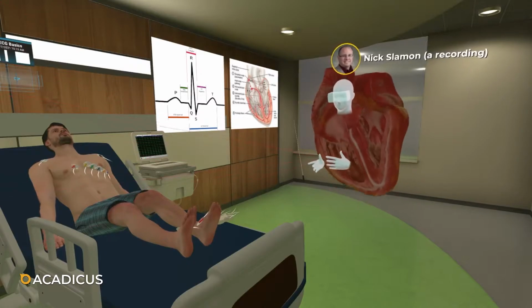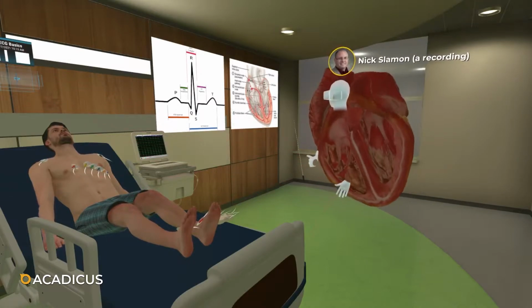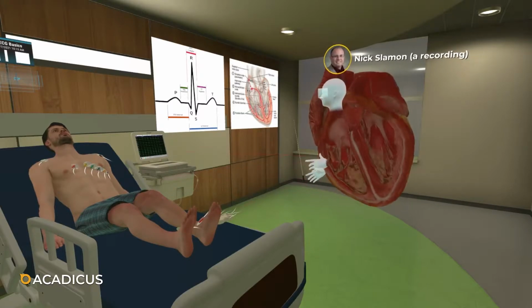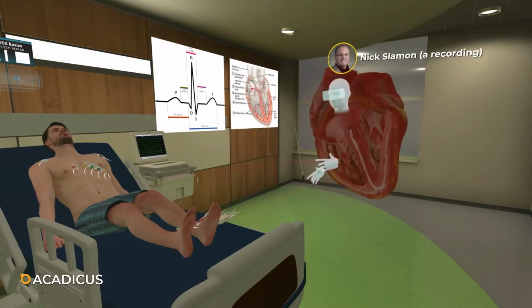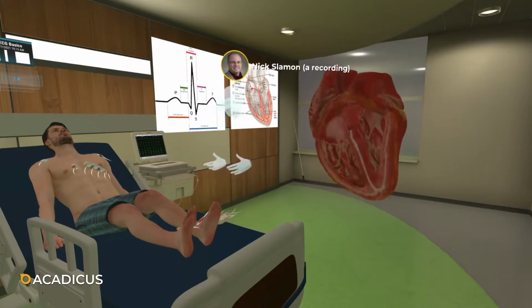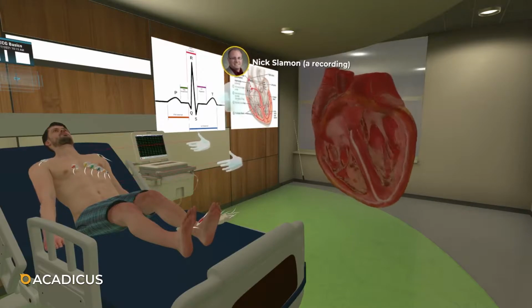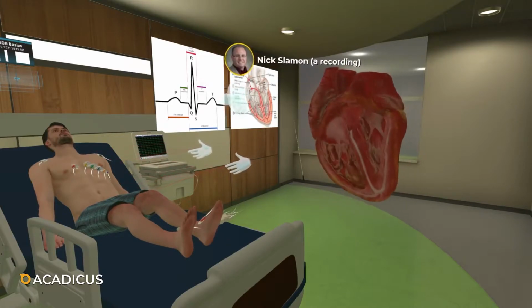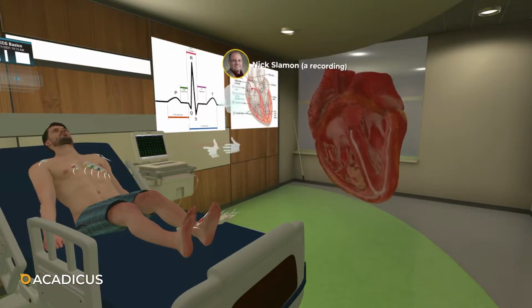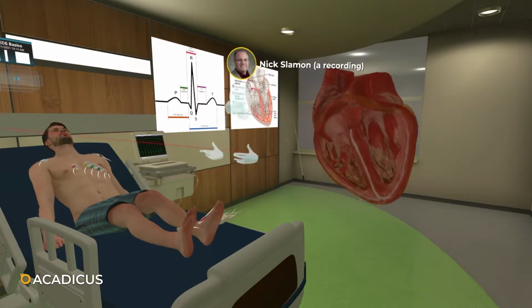In today's tutorial, we're going to go over some very important but very basic concepts surrounding EKG. So let's start with our patient here, Simon, and notice that he's got 10 stickers on his chest, 10 leads hooked up, and he's hooked up to a Philips 12-lead EKG machine.